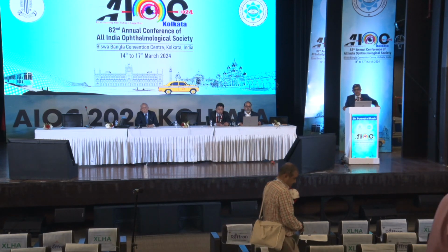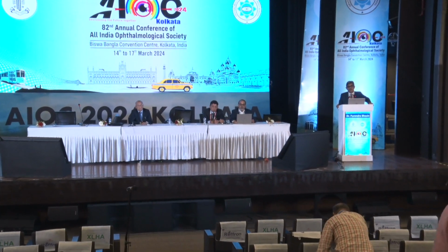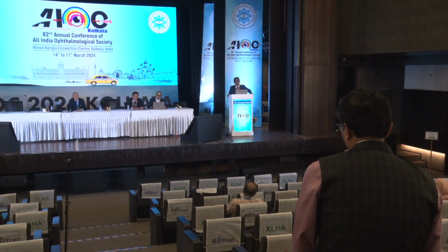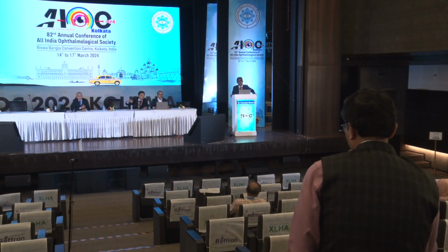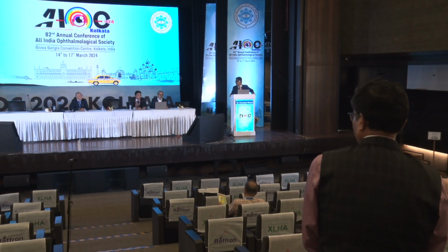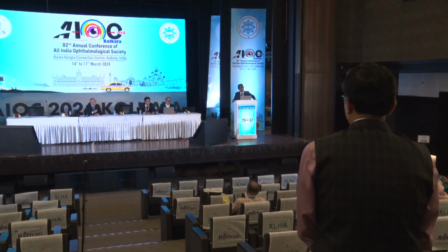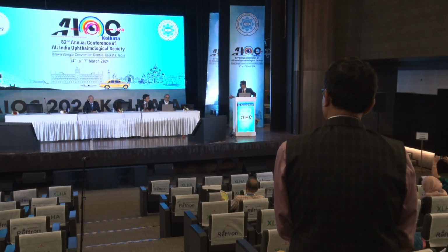One question. Often we find patients who have been implanted with bilateral IOLs and still they have a lot of residual refractive error. So it is very difficult to find companies dealing with piggyback IOLs. So in that scenario, can we go for ICLs to correct the residual refractive error? I think we have a talk on this, which will be dealt with. I think Dr. Ramamurthy is going to tell about it. But definitely, it can be used, but it is expensive.